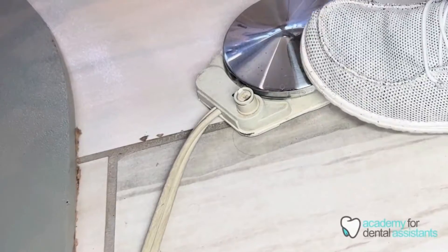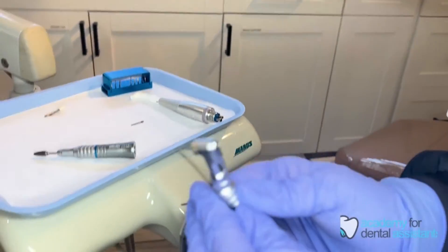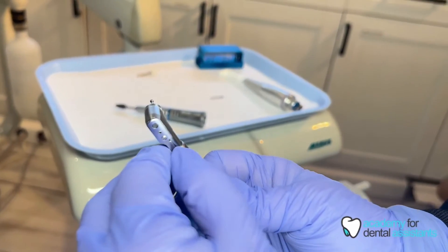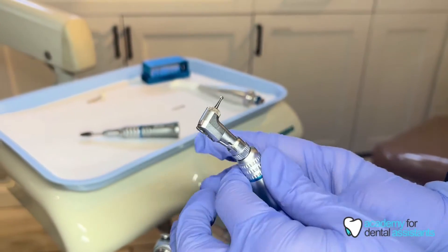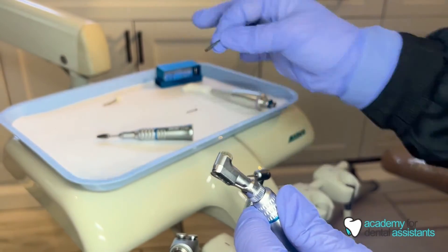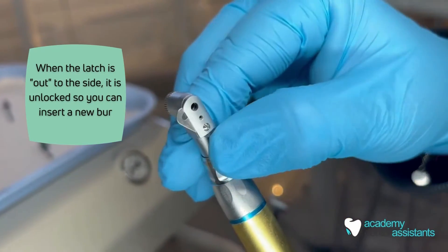Press the rheostat to make the motor go and ensure that the burr is locked in place. To remove the burr, you simply unlock the latch in the back by pushing it to the side and remove the burr.